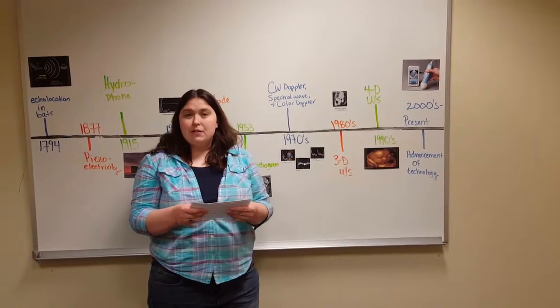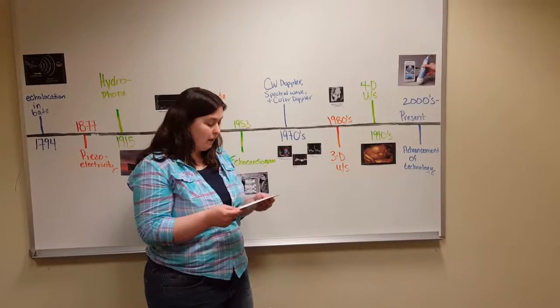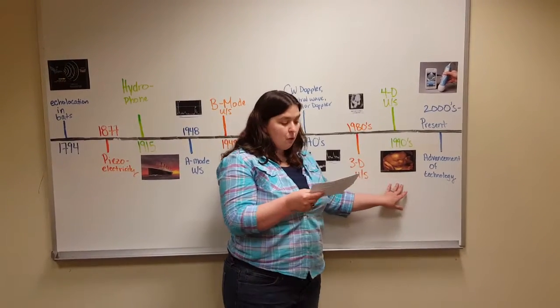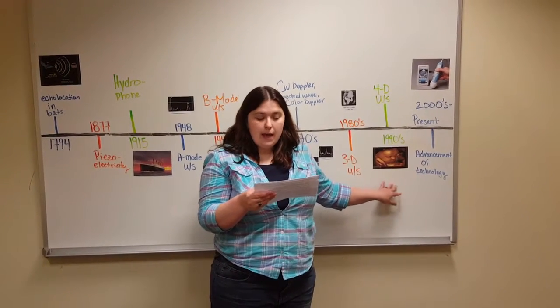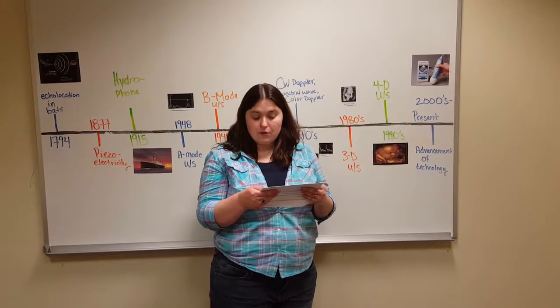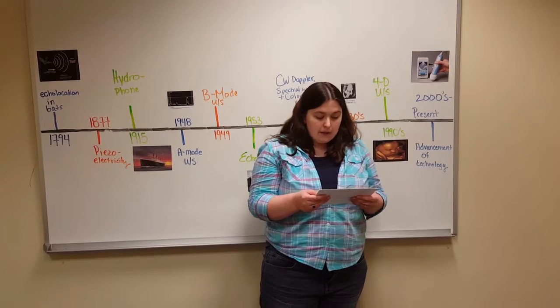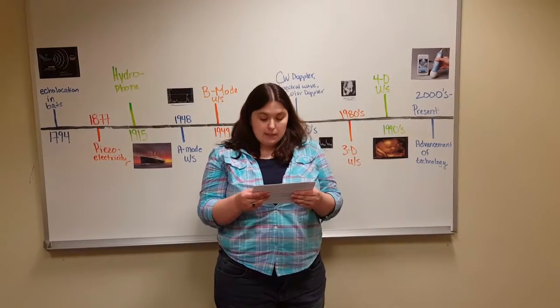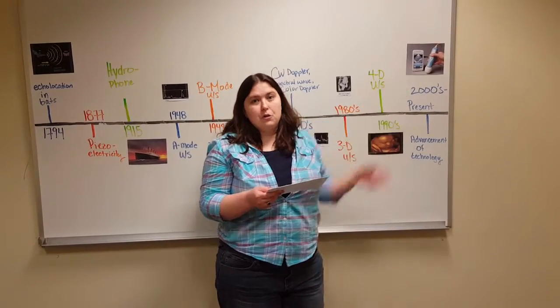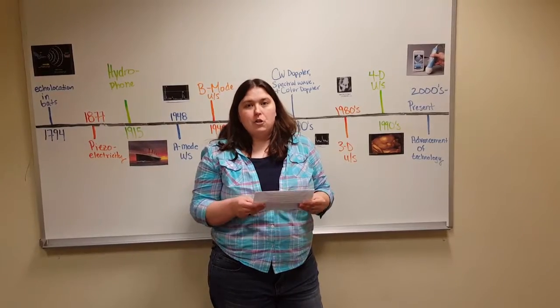This led to some ultrasound technology becoming more sophisticated as the improved image quality happened. In the 1990s, adoption of 4D real-time capabilities aided in ultrasound-guided biopsies, including endoscopic ultrasound. And in the 2000s to present, there continues to be technological advancements, which includes compact or portable transducers being able to hook to your phone so you can go to the bedside for the patient if they're too ill.